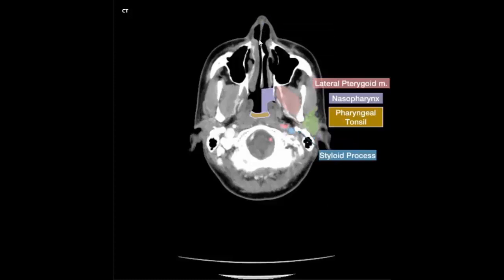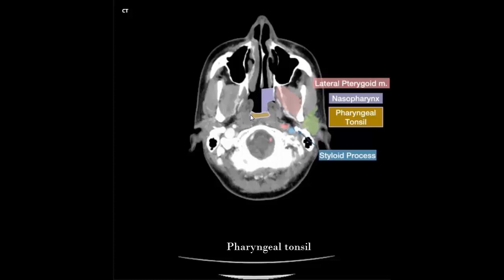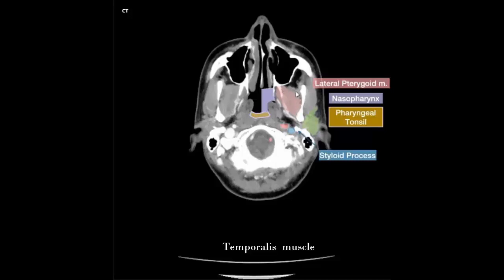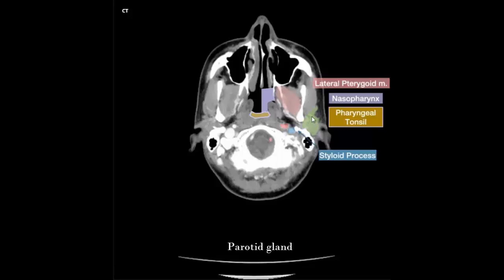Nasal septum, nasal cavity, maxillary sinus, nasopharynx, pharyngeal tonsil, lateral pterygoid muscle, temporalis muscle, masseter muscle, parotid gland.